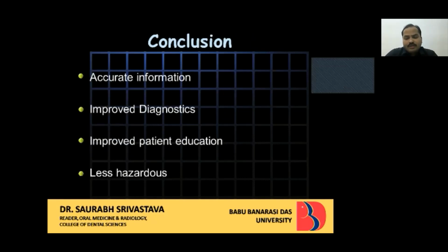So to conclude, we can say that CBCT also provides accurate information like medical CT. There is improved diagnostics and imaging as compared to conventional radiography. There is improved patient education, because newer tools for patient education like 3D printing or 3D reformatting can be utilized, and it is less hazardous than the medical CT machines.